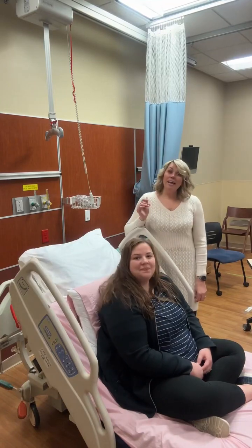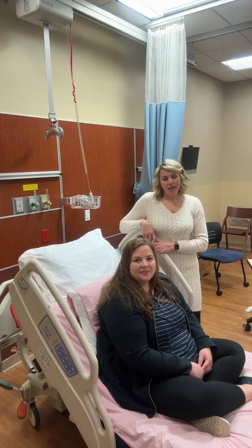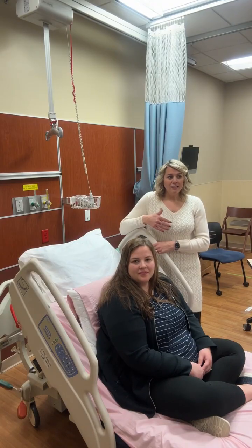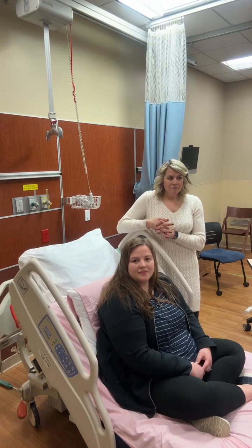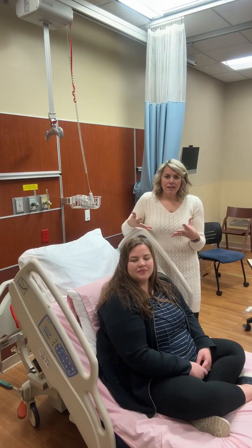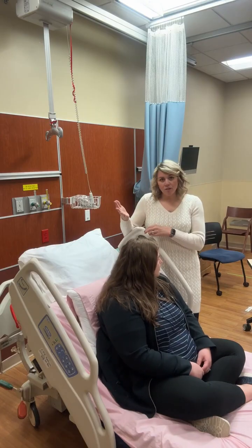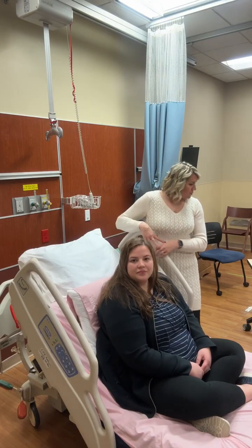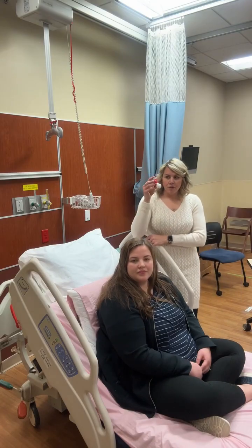We're going to talk about inhalers because we use them frequently in the sim lab, and I want everybody to see how they're used and the indications for why they're used. So maybe if you hear me tell Ashley how to use the inhalers, it might stick a little better. I'm going to start with albuterol. We've already gone over nebulizers, so now I'm going to talk about an albuterol inhaler, okay?